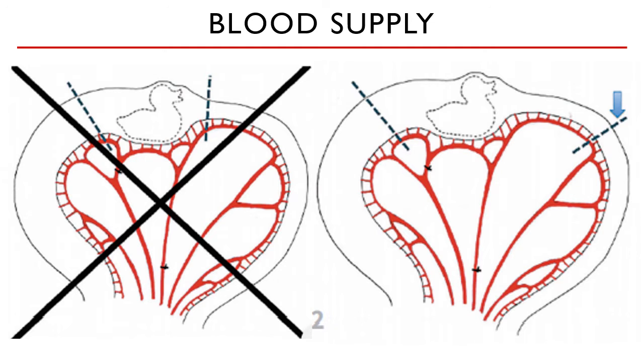Look at the size of the lumen on both orad and aborad intestinal regions. The orad region is dilated due to the blockage. We already know how this happens. And the aborad one is of normal lumen diameter. How would you join the two if they have different sizes? This is what we call luminal size disparity. How do we fix this?